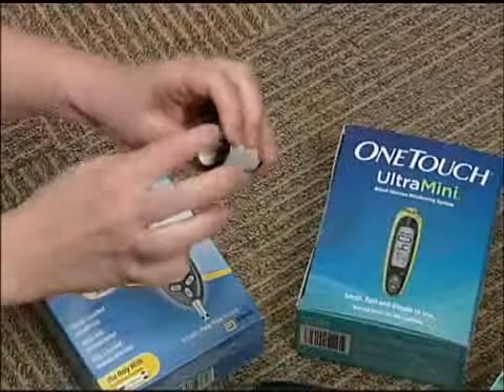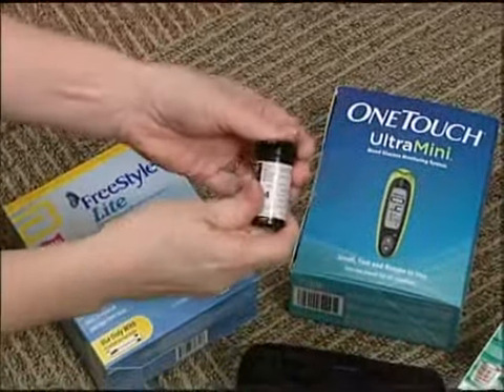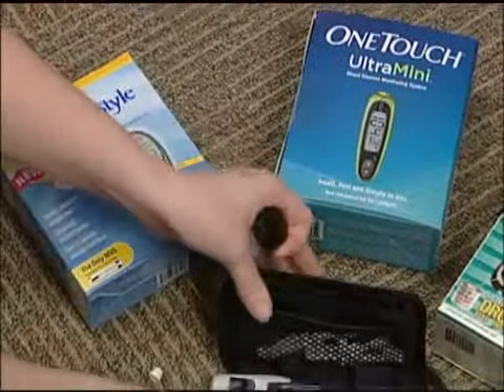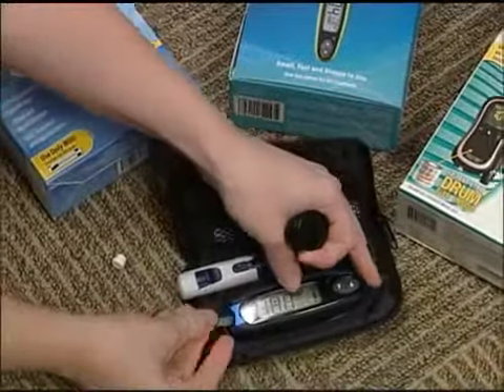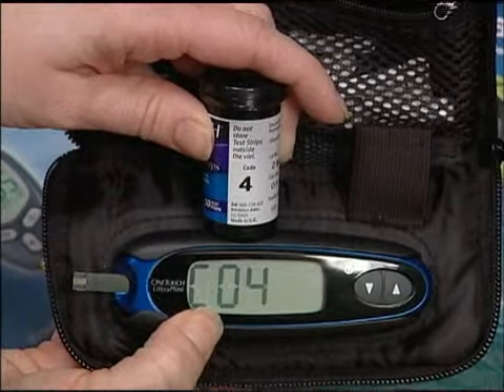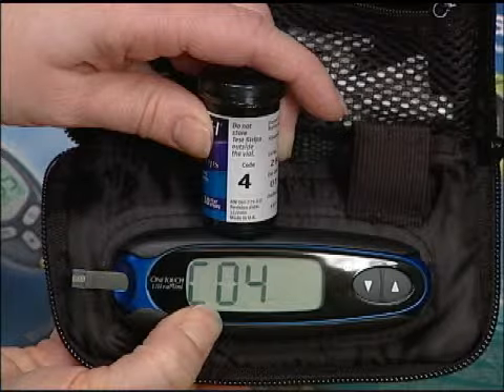Once you've loaded your lancet and put the cap back on, pull out the test strip and insert it into the meter. Most meters turn on when you put your test strip inside. Once it's on, you always want to check your code if it's a coding meter — you want them to match. If they don't, you need to change that before you test, otherwise your test will not be accurate.